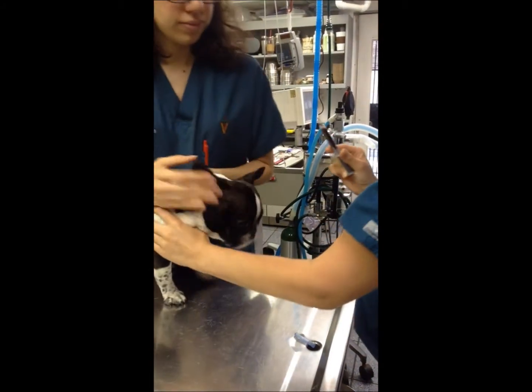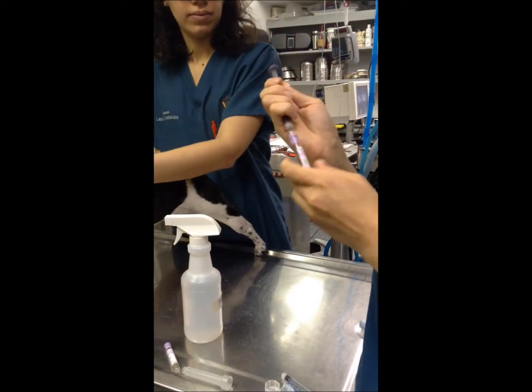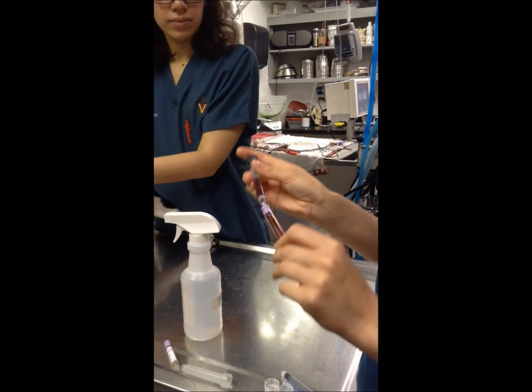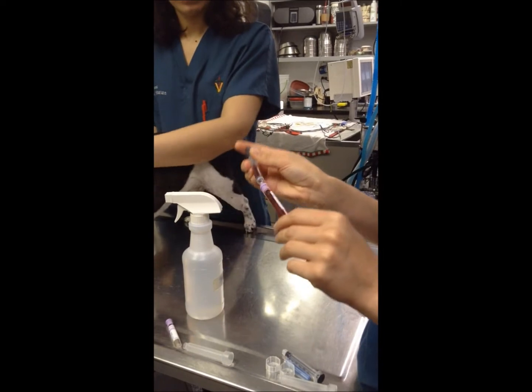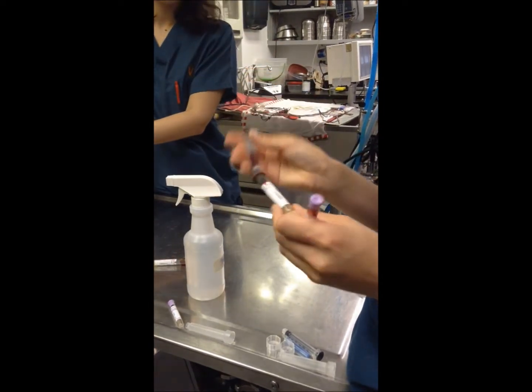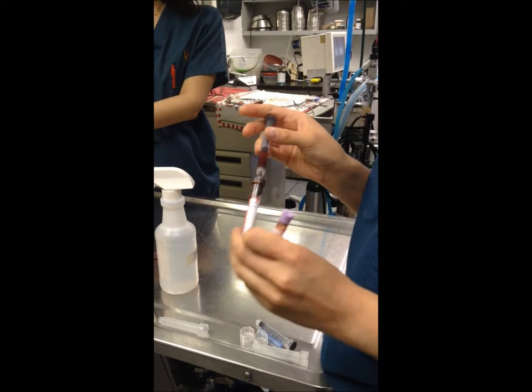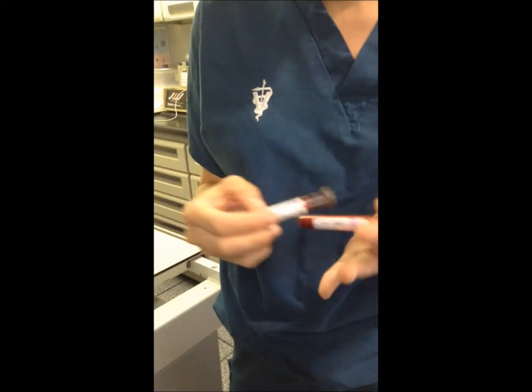Okay. Take some blood from Ruby for our donor cells. Okay, and then we're gonna stick part of the blood into a lavender top so that it doesn't clot. You rock it back and forth. And then some in a serum separator. And then you label it with donor and her name. That's it. We have her name on both of the tubes.